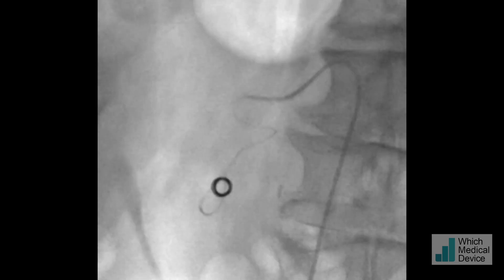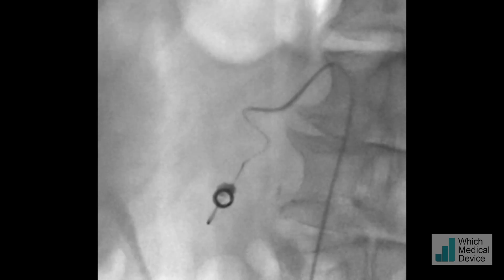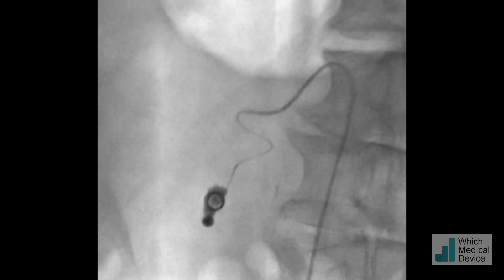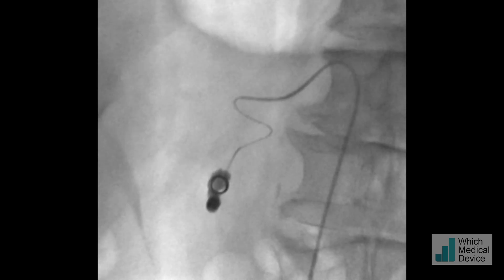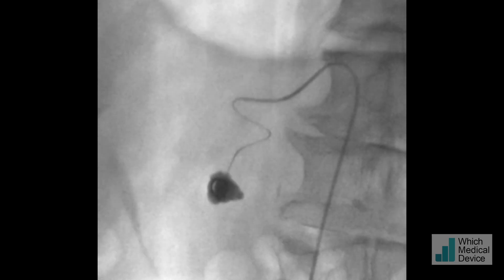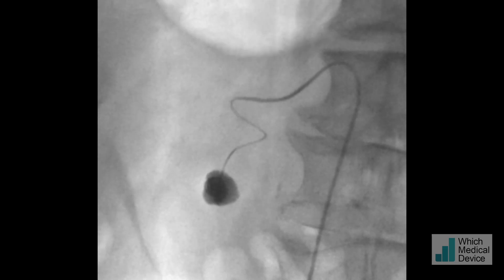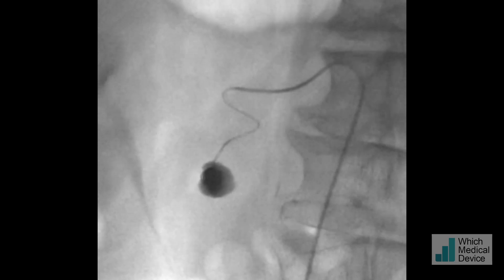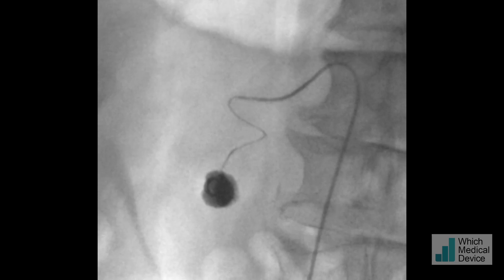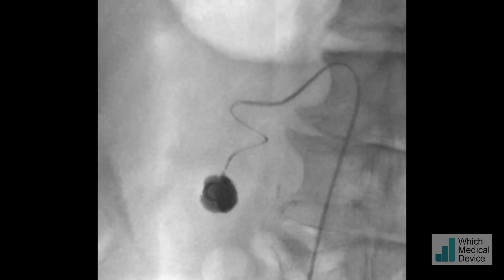This was in a ratio of one glubran to six lipiodol. As I inject it, I'm going to pull the microcatheter back to make sure it doesn't stay engaged in the glue. Remember that the cavity is filling from posteriorly to anteriorly, so even though it might appear to be filled, it's not — you're still injecting the glue and it's coming anteriorly to fill the lumen. I keep injecting until it fills right up to the neck of the pseudoaneurysm, then very rapidly pull the microcatheter out. You can see a tiny amount of glue prolapsing back into the cavity when I take this out.